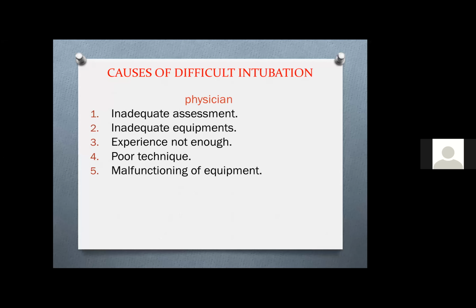It's an equipment failure. It's not your fault, it's not the nurse's fault, but equipment failure is affecting your ability to intubate patients. Or you wanted to use the laryngoscope, then you put it in, you attach it, the light is not working. And why is that? Oh, the battery is dead. We need to change a battery. And we don't have a battery around.